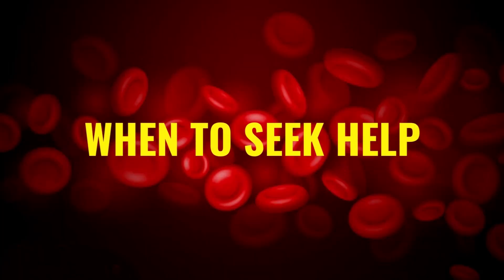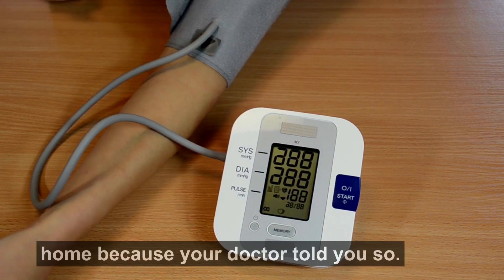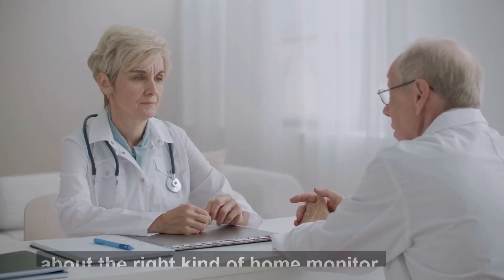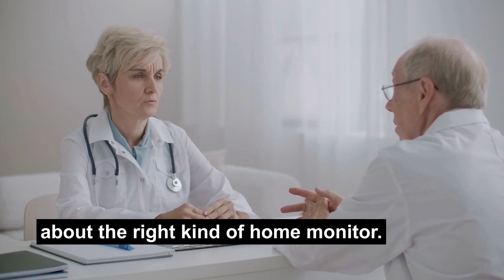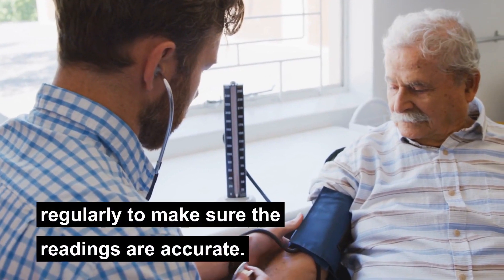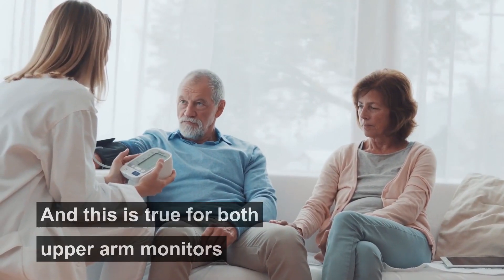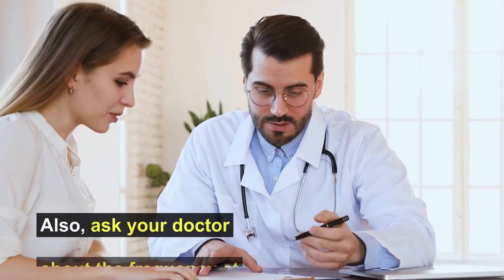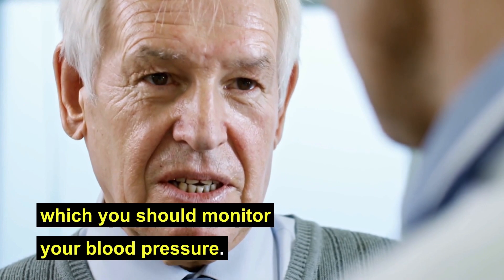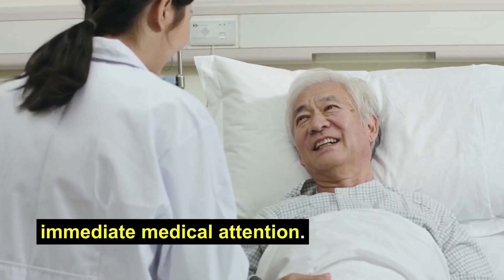It's important to know when to seek help. You probably measure your blood pressure at home because your doctor told you so. In such a case, it's best to ask your doctor about the right kind of home monitor. Ideally, you should take your monitor to the doctor's office regularly to make sure the readings are accurate, and this is true for both upper arm monitors as well as wrist monitors. Also, ask your doctor about the frequency at which you should monitor your blood pressure, and if anything looks off the chart, seek immediate medical attention.